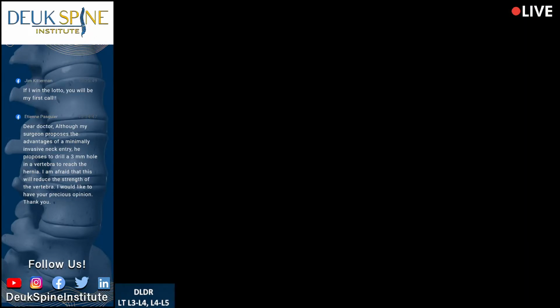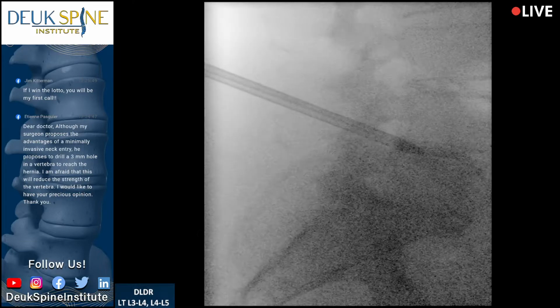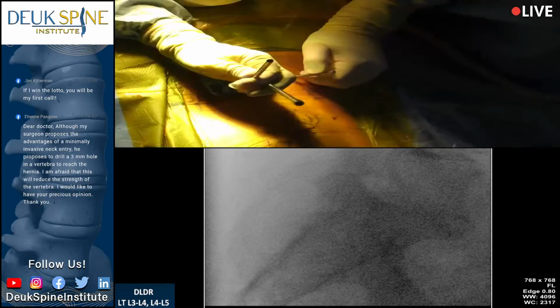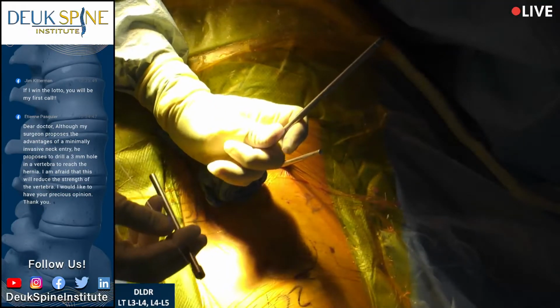She's doing amazing. She's so helpful. Laying still. This is the more stimulating part. Yep. So as we enter the disc with the dilator, this is going to be the more stimulating shot. Yep, that's good. Take that. Let me feel it. Feels good. Go ahead. All right, I need to go in just a little bit further. Shot. You're doing great.